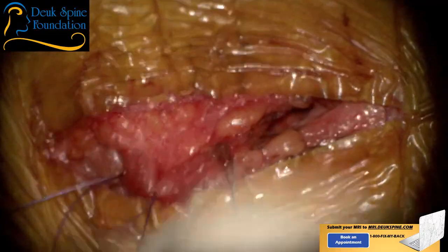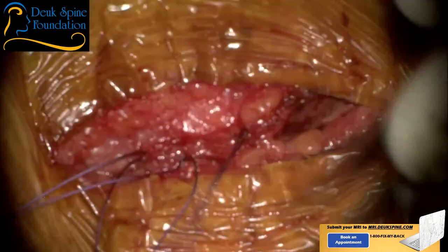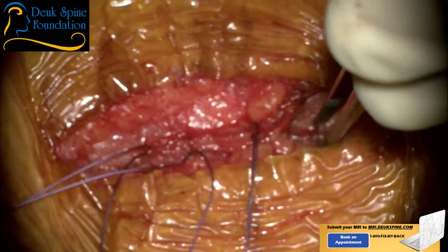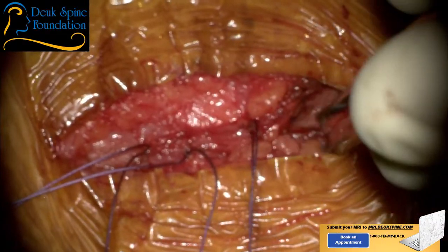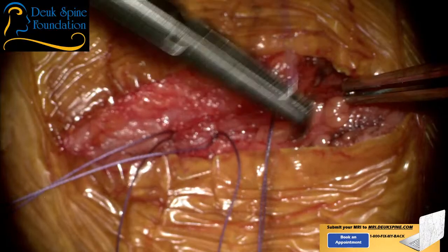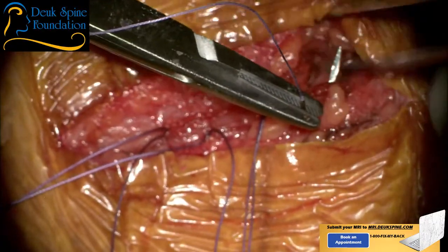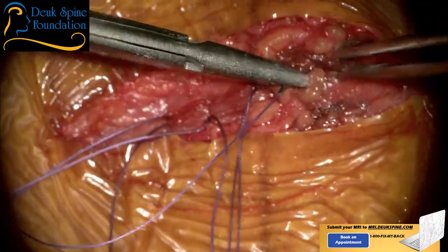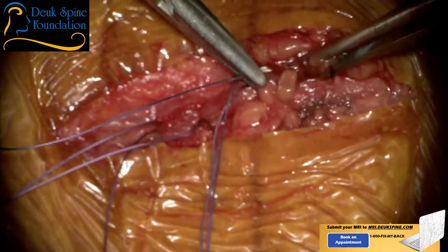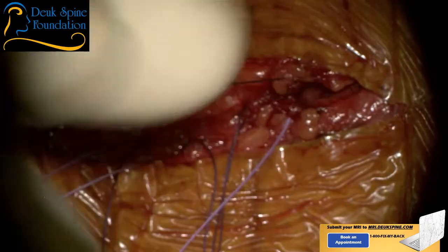I thought these are the ones we're going to use for the sub-Q. Not for this one. This one we have the other. Okay. Yeah, one more should be enough right here. Dr. Patel nails that one. Yeah, grab it there, and I'll just put the needle right behind your grabber, or right next to it. There you go. And when you get the platysma, careful over there, there's veins over there. So yeah, that's fine. When you get the platysma, oh no, grab the needle, not this muscle. You want to make sure you get the fascia around it, okay?